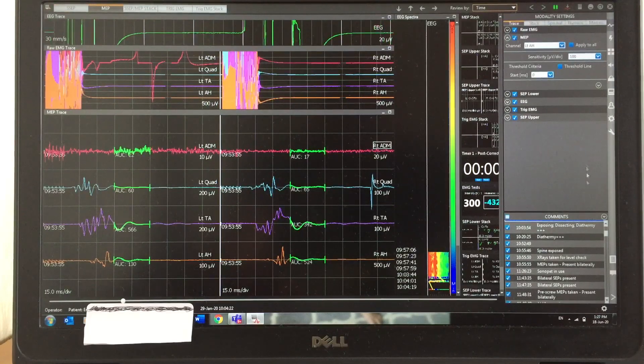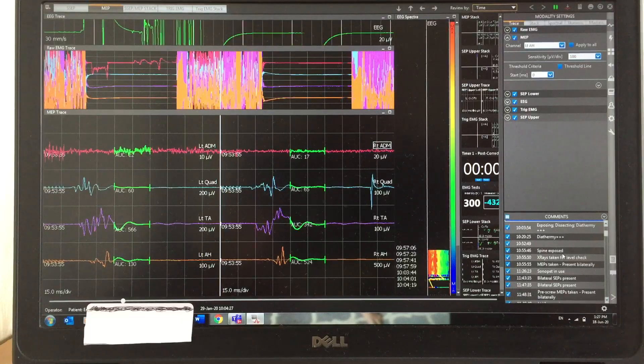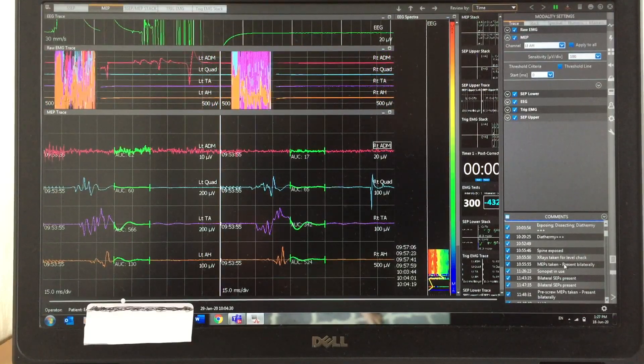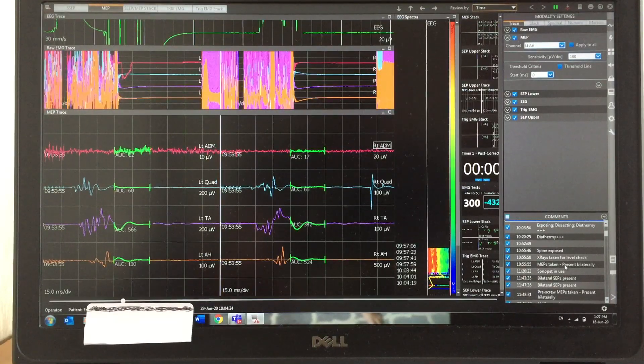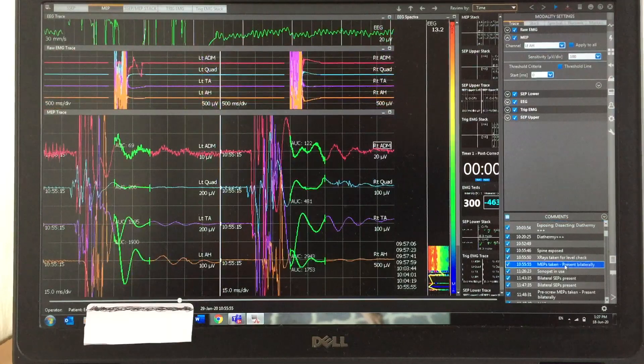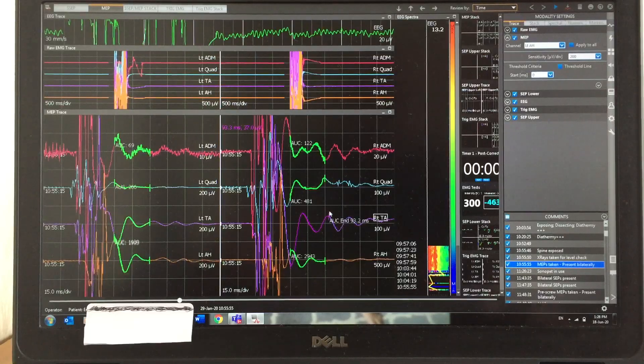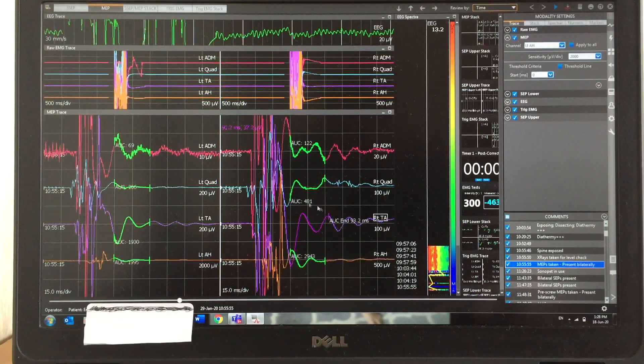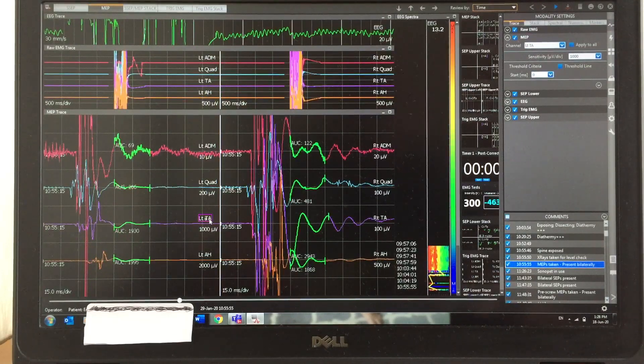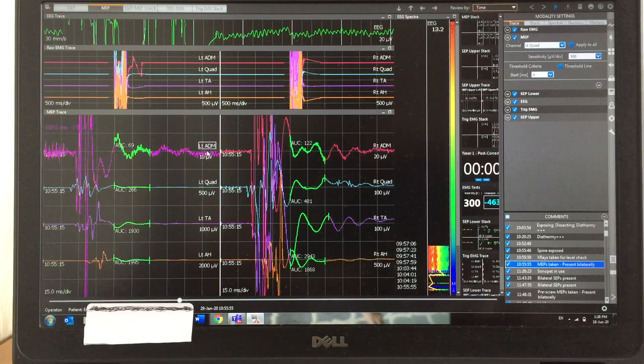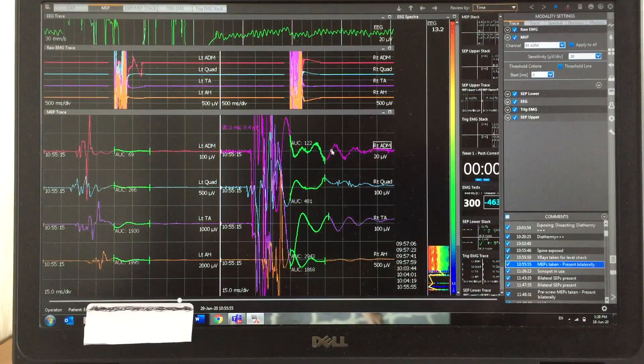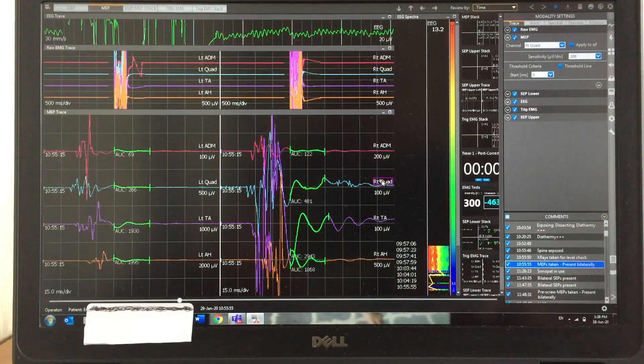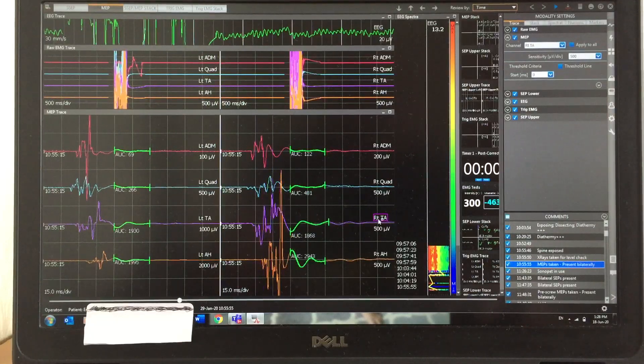Here you can see the comments: diathermy, spine exposed, x-ray taken for level check, MEP taken and present bilaterally. Now you can see the beautiful high amplitude MEP responses. I'm going to bring the MEP channel sensitivity low so you can easily see the clear-cut MEP responses.